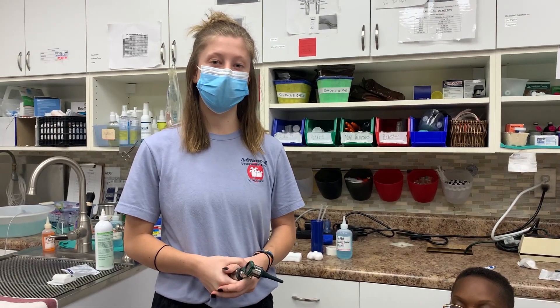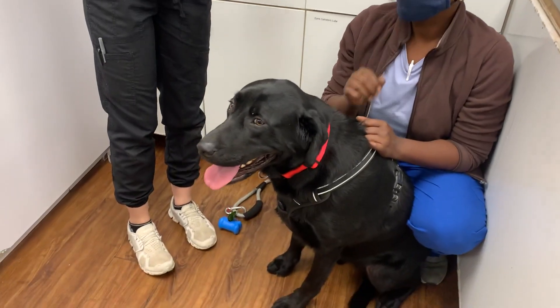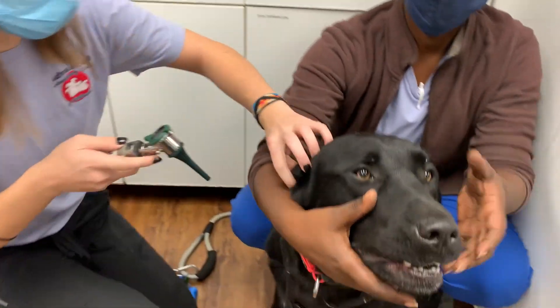Hi, my name is Taylor, and I'm going to show you how to clean and medicate a canine's ears. This is Murphy, and first I'm going to check with an otoscope to look inside the ears.